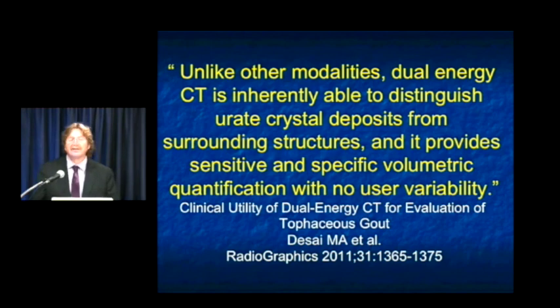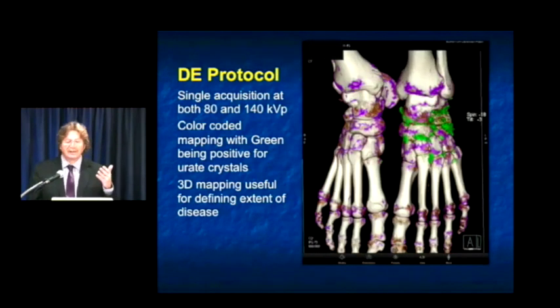And so perhaps it's a good way for us to think about, perhaps we can use dual energy, and Satomi Kawamoto at Hopkins is looking at this, looking at pancreatic tumors, for example, to determine the aggressiveness of tumors, to determine how tumors respond to therapy. Can you predict whether response is working? But dual energy has a lot of potential features.